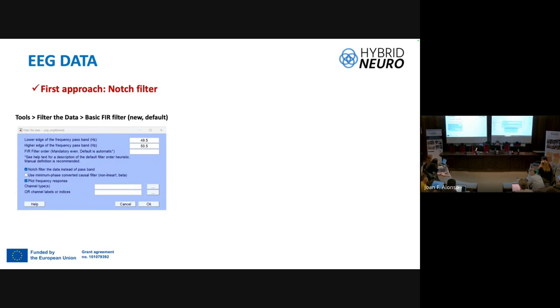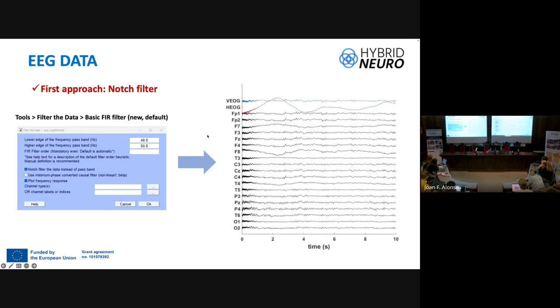This is the design of the filter, okay? And we can call this a new data set with the filtered signals. We can name it EEG filt, for example, okay? And we can now plot our signals. Okay, you can see it here. And please pay attention to what happens in the first and also in the last seconds of the signals after filtering. Okay, this phenomenon is known as edge effect, and needs to be considered when filtering. Okay, the length of the distorted data depends on the filter settings.